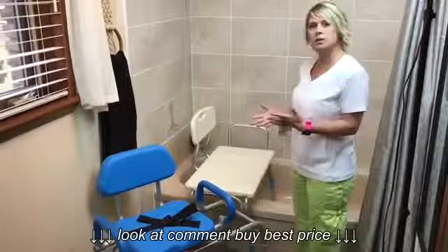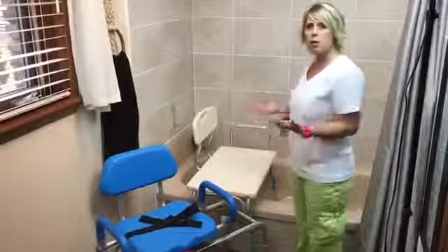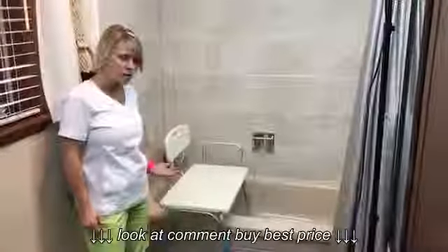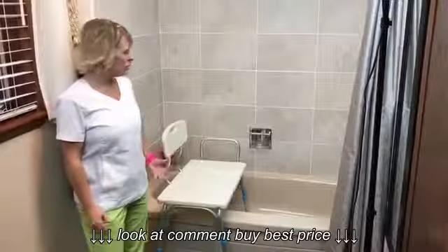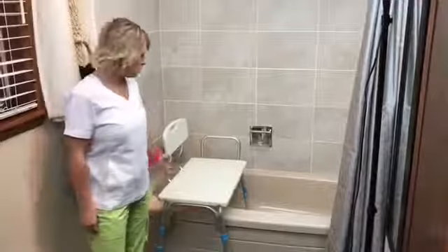Today we're going to compare an older model and a newer model and go over the pros and cons of each one. First, you want to make sure that the legs are set at a proper height for you and that the bench is level. Then I'm going to show you how easy it is to do a transfer on this type of shower bench.